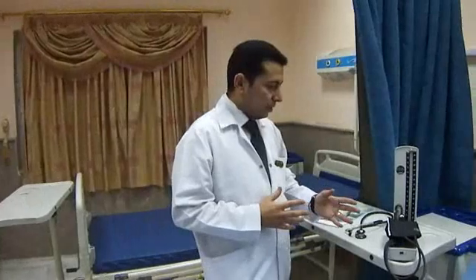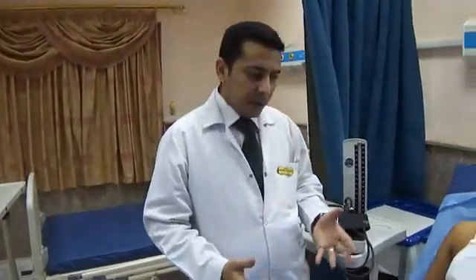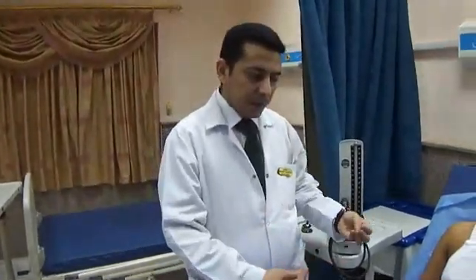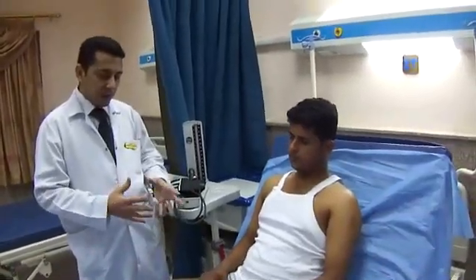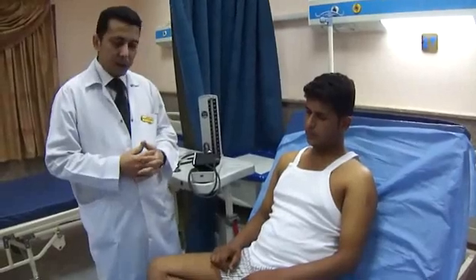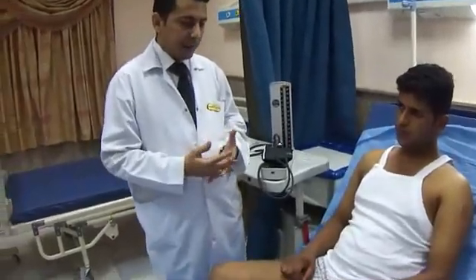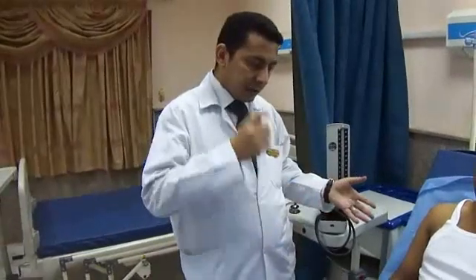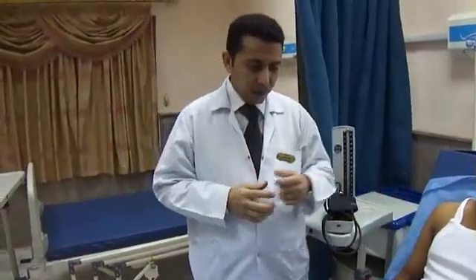First I'll check the blood pressure. For blood pressure measurement, the patient should be seated comfortably for at least five minutes, and we have to ensure that the patient hasn't had any cigarette smoking, tea, or coffee for at least 30 minutes prior to assessment.